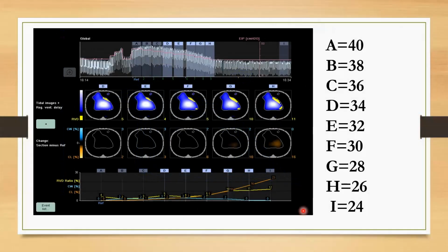We look up here, you notice that there's no PEEP, there's no green PEEP line. This is on APRV, so we use the customized analysis. We're looking at CW in blue for compliance win. Compliance loss will appear in orange. We're using very high pressures, and we would never really do this unless it was guided by tomography, but there was significant distension. So we have to push back against that pleural pressure.